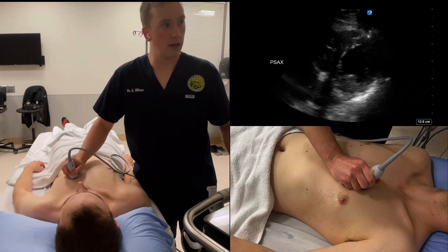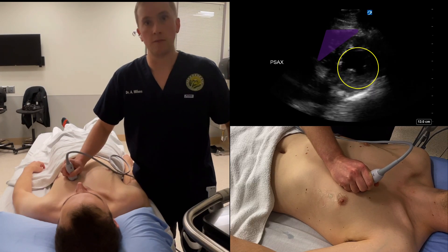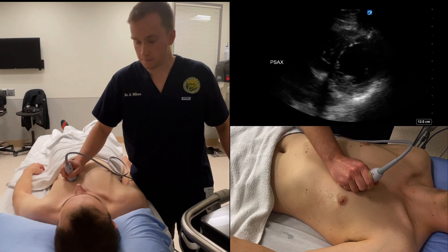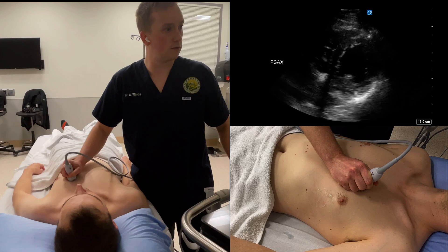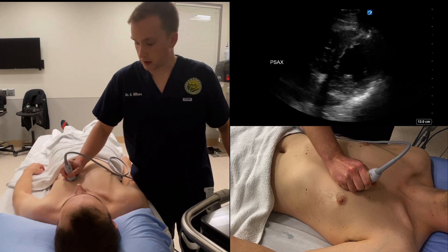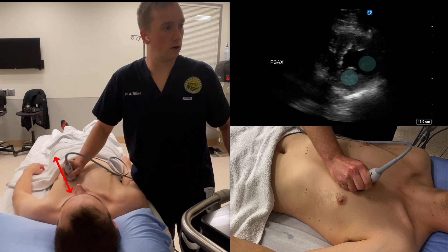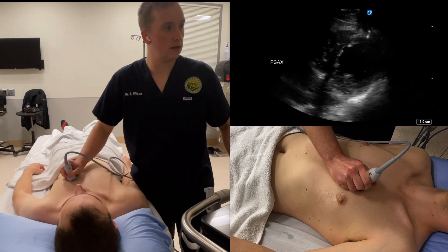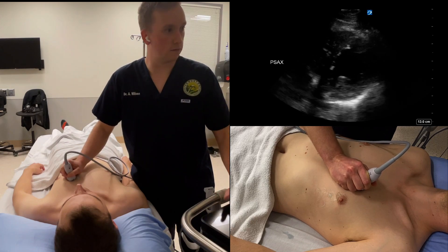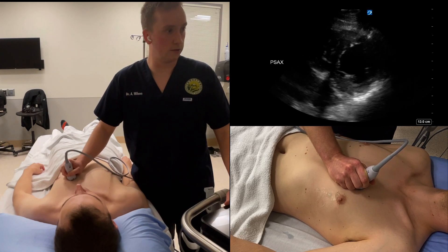The image should display the right ventricle in the near field and the left ventricle in the far field. There are multiple imaging planes for the parasternal short axis, but for this tutorial we'll focus on the mid-papillary level, as that allows for a more reliable assessment of LV systolic function. To obtain the mid-papillary level, you may need to fan the probe either cephalad or caudad, looking for the circular cross sections of the papillary muscles coming out from the inner surface of the left ventricular wall. You should also see the entirety of the left ventricle. If you're having trouble, rolling the patient into the left lateral decubitus can help.